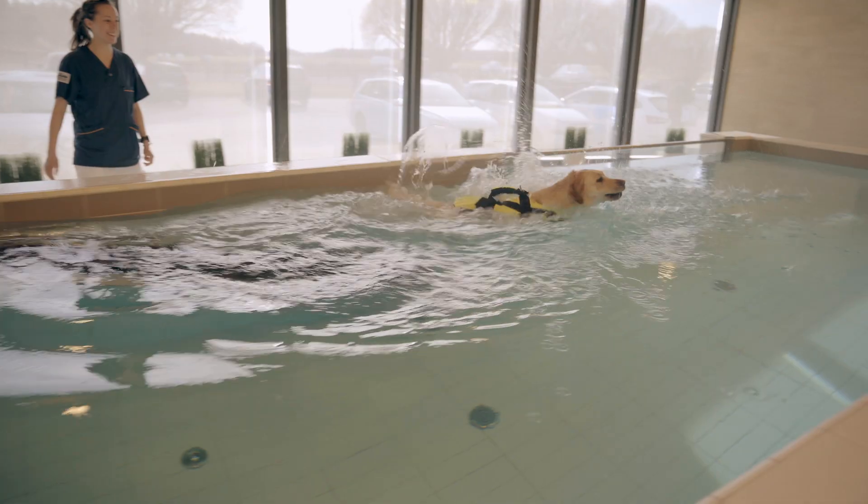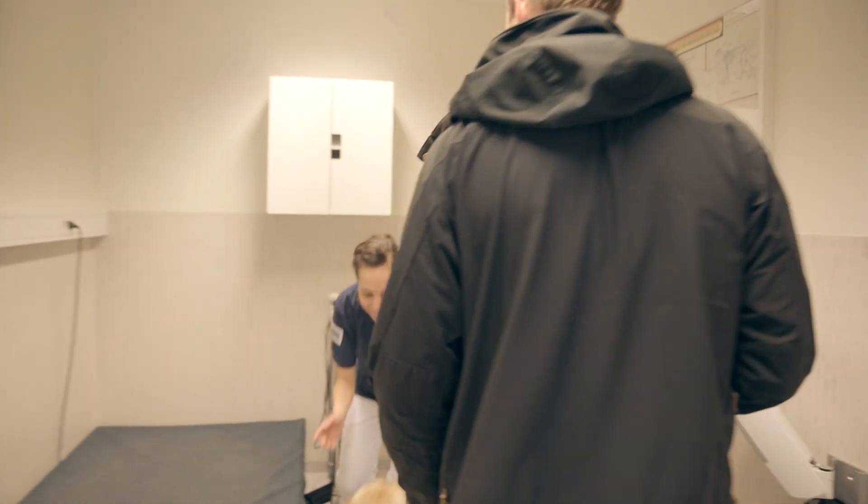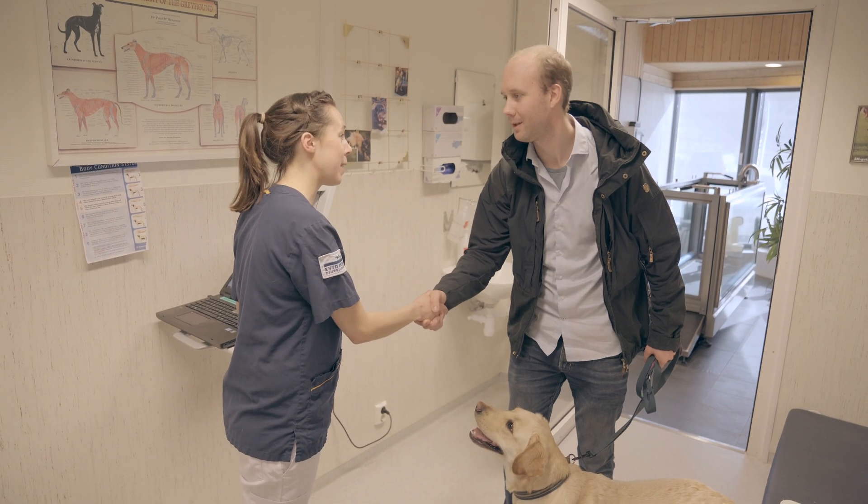With time saved to focus on treatment of the injury, you will have the pet back on her feet in no time. That's one more happy customer.